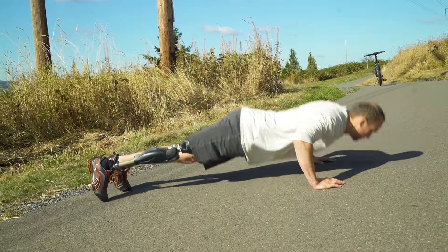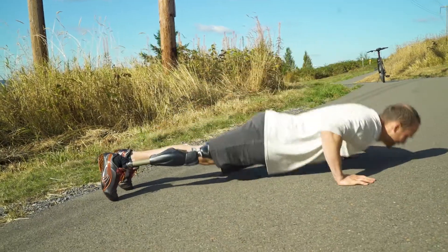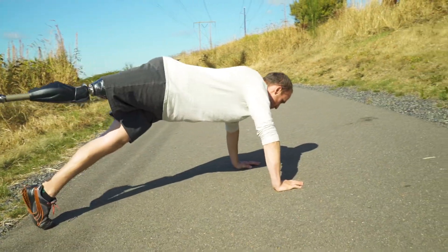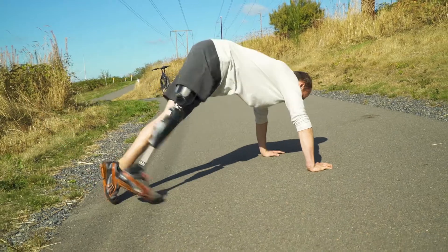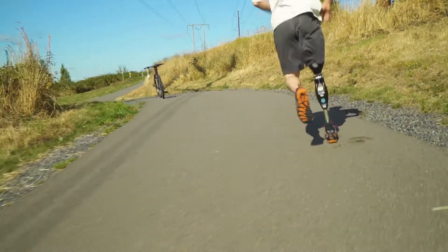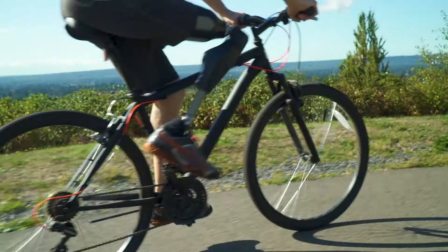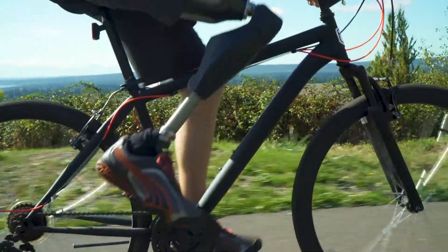I highly recommend Cornerstone Prosthetics, especially if you're an above-the-knee amputee. Mike and Dave over there are just overall great people. They have some of the best technology and they take really good care of you to make sure that you're comfortable and have what you need to live an active lifestyle.